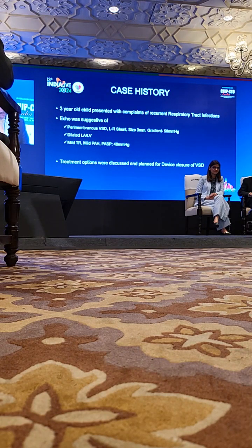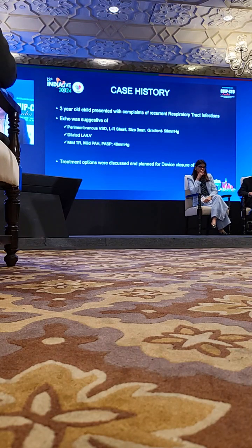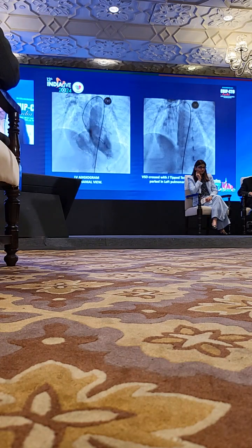So mine is a 3-year-old child who presented with complaints of recurrent respiratory tract infections. Echo was suggestive of a 3 mm VSD with a left to right shunt and a gradient of about 50 mm mercury. LA and LV were dilated and the child had mild PAH. Treatment options were discussed, and since there was about 4 mm gap away from the aortic valve, we decided on device closure of VSD. So I had a 5 French femoral artery access and a 6 French femoral venous access.